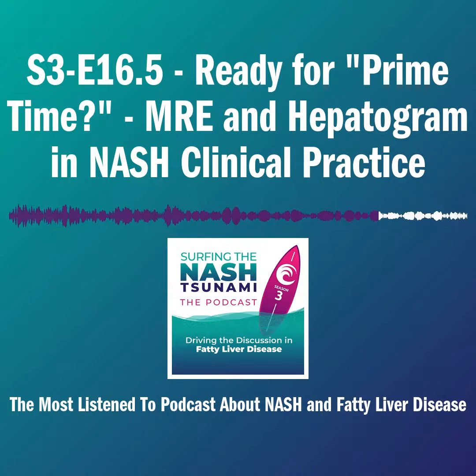Kay, you're nodding, so I'm going to invite you to go first. I'll preface this with, I'm not that kind of doctor. But I will say that if I were practicing, I would send my patients that I was suspicious for non-alcoholic fatty liver disease to get an MRE and PDFF. Stop asking them to have a biopsy. If we're not suspecting other etiologies of liver disease, we don't need a biopsy for that anymore.